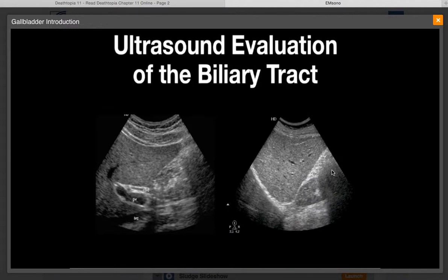The evaluation of the biliary tract is complex since it involves evaluation of the gallbladder, the liver for intrahepatic ductal dilatation, as well as the common bile duct. Technically, the common bile duct is difficult for the beginning sonologist to evaluate. Therefore, in this module we will focus on mastering the findings of the gallbladder. In later modules, we will cover the evaluation of the common bile duct as well as the intrahepatic ducts.